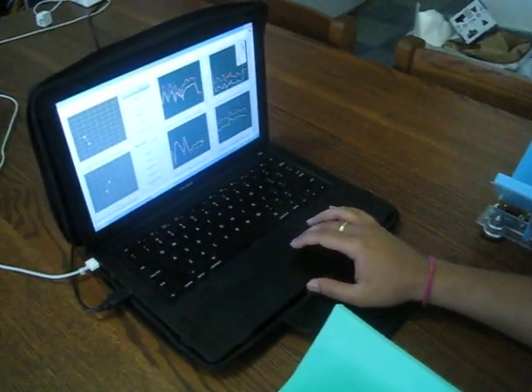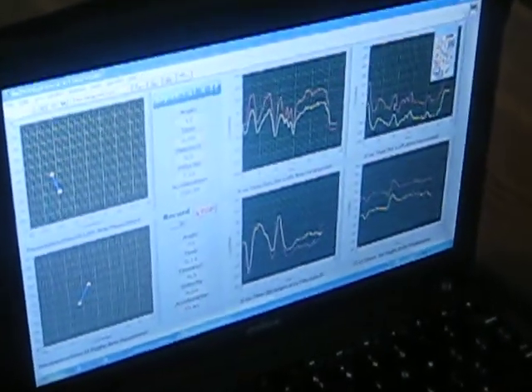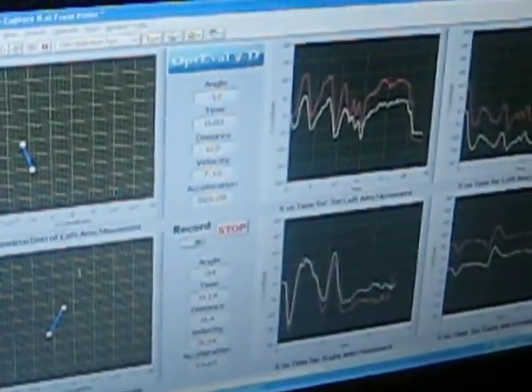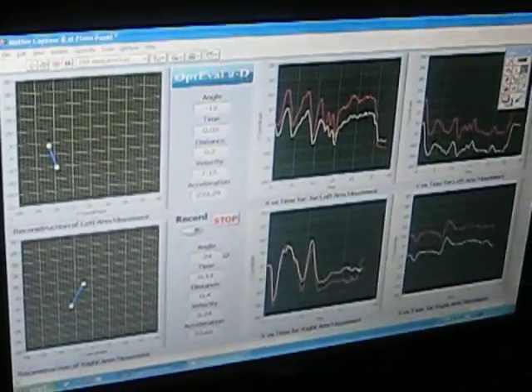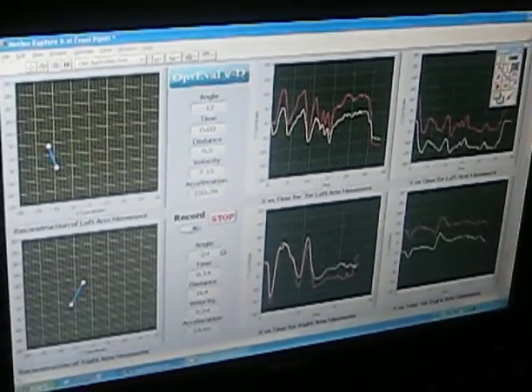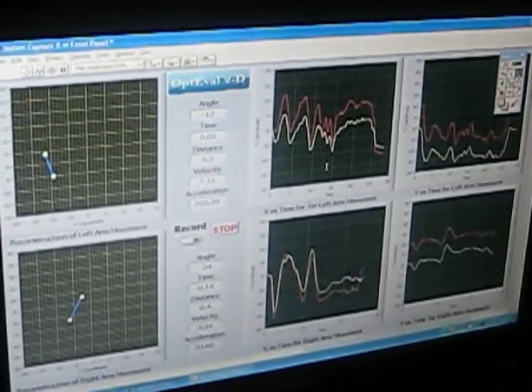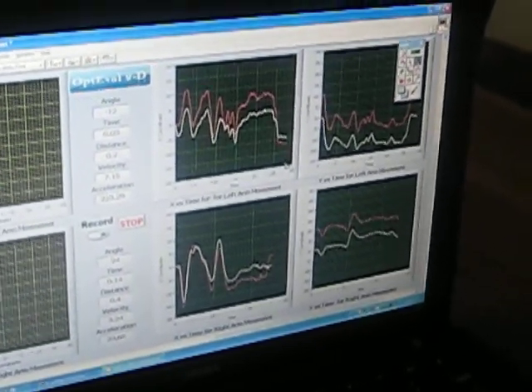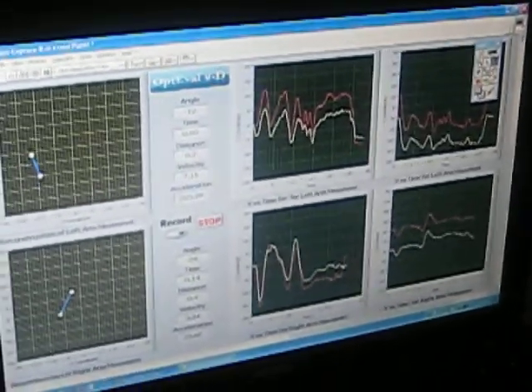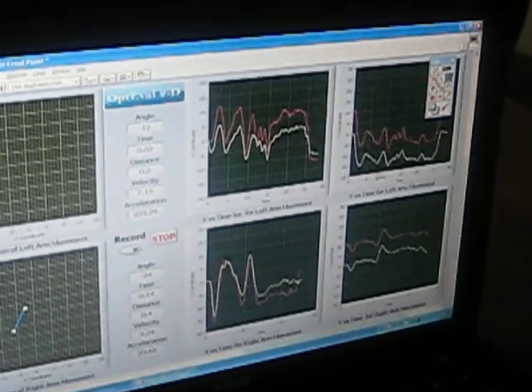And as you can see, this is the code that reconstructs the motion. All the graphs on the top are for the left arm, and all of them on the bottom are for the right arm. So these 2 on the left provide a reconstruction of what's going on. The values over here provide data on one particular motion, every motion that's made. So one of the key points is the total distance of that movement. And the 4 graphs over here are just outputs of what's coming out from these sensors, so you can see what's going on. Red and white are for each sensor, and the left is for the X direction and the right graphs are for the Y direction.